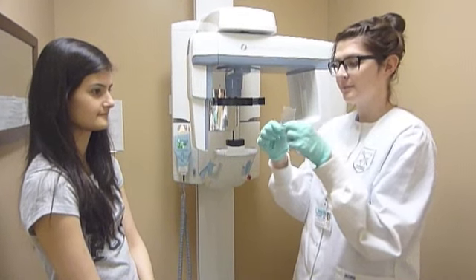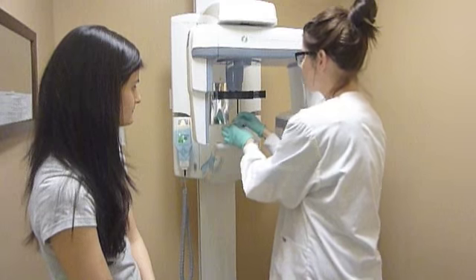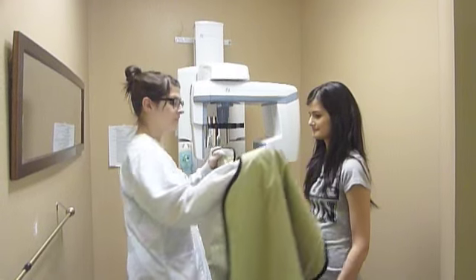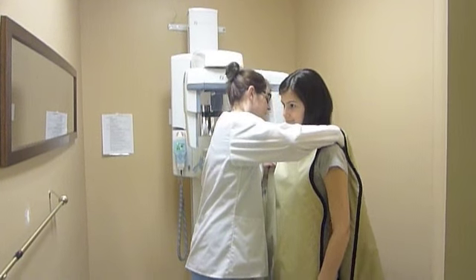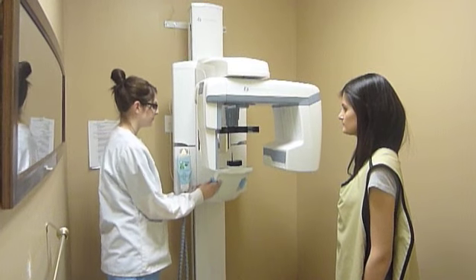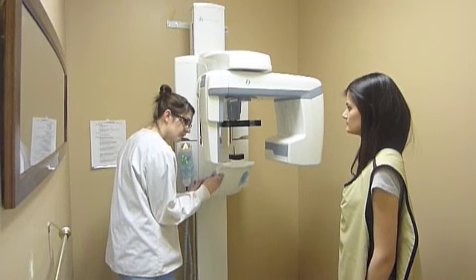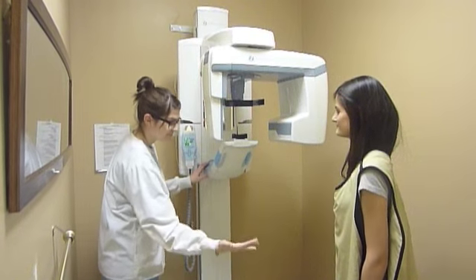Before the dental hygienist takes the exposure, she must place the bite block barrier on in front of the client. Next, the dental hygienist must place the double-sided lead apron on the client. Notice there is no thyroid collar. Use the up and down buttons on the panel to adjust the height to suit the client.